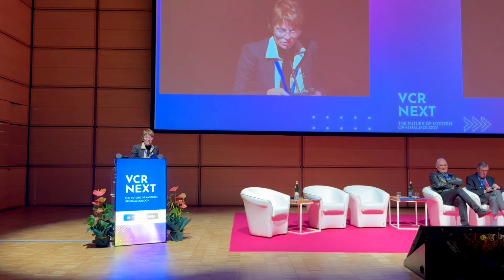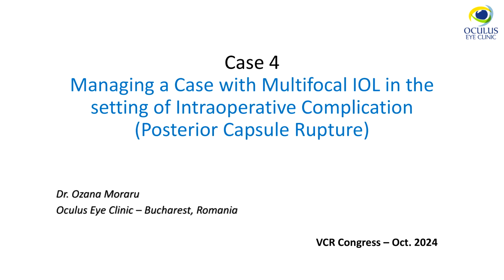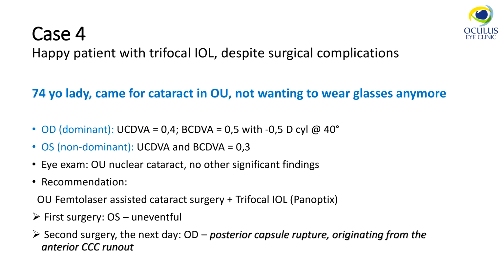I'm gonna present my second presentation from this session. Managing a case with multifocal IOL in the setting of intraoperative complications such as posterior capsule rupture, which you will be seeing at PCR. The 74-year-old lady came for cataract in both eyes, not wanting to wear glasses anymore.